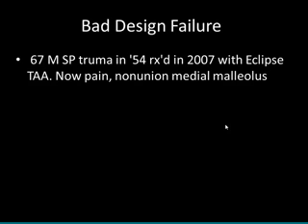I think certainly if I'm revising an ankle and they're big, then I'm using allograft bone. But in the last case I mentioned to you about the STAR, it was such a big cyst in the talus, I was worried about imminent collapse, and so I filled it with cement, and we'll see how that does.